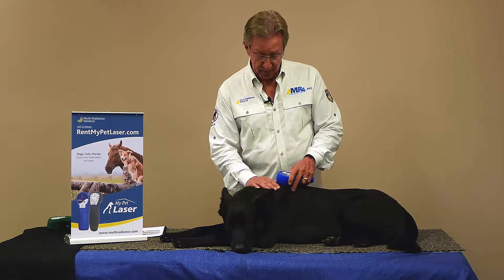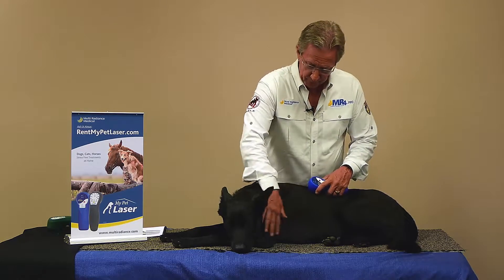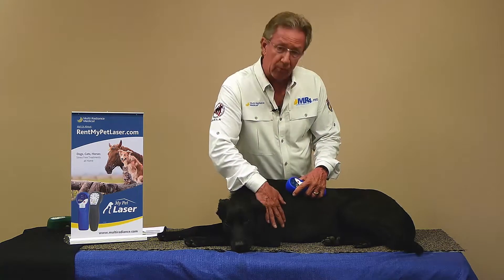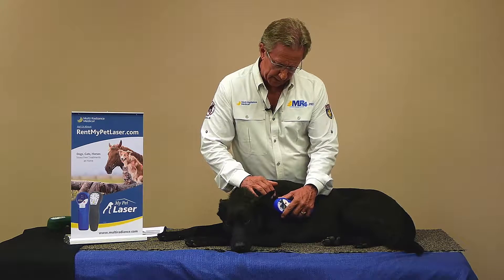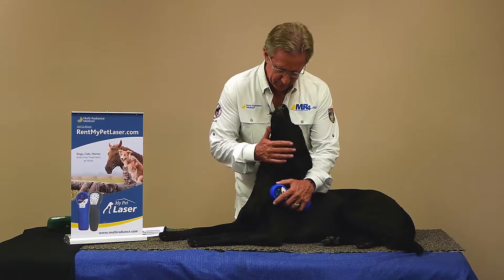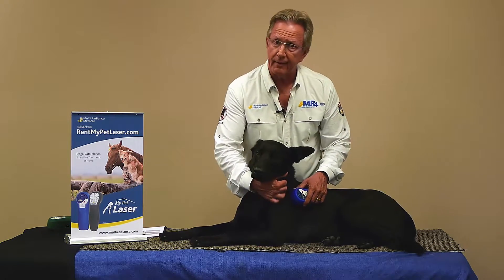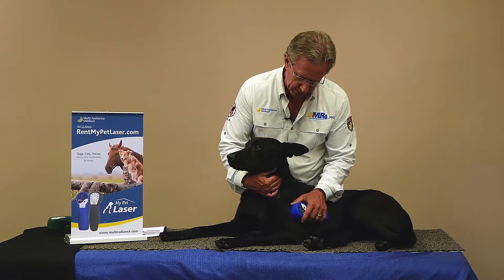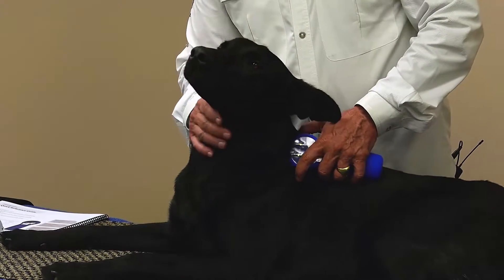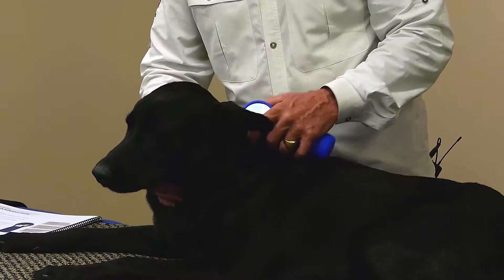You remember your high school biology classes — adenosine triphosphate — that's the precursor to creating new healthy cells that then proliferate to where they're needed. So in the case of a wound, we'll just pretend that Eric, our beautiful Belgian Malinois, has a wound here on his shoulder. We'll just treat around that area, scanning at about a centimeter per second where we have inflammation, and they just love it. They're so comfortable with our lasers. Whether it's a lick granuloma, or maybe your dog got in a fight or was hit by a car, you're just scanning around that area. It's especially good to promote healing — you can accelerate healing and it's a very complete healing. It uses the power of light and has no side effects. So instead of drugs with their side effects, we're using laser, which has none.